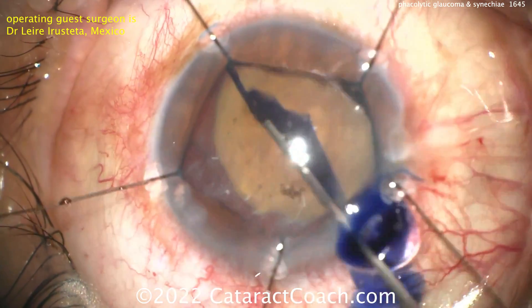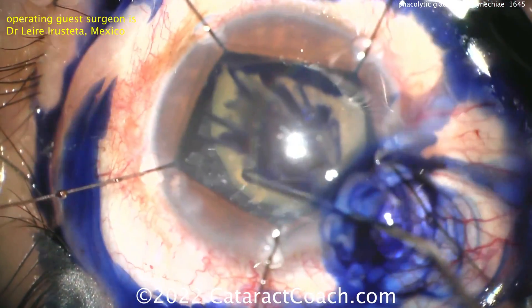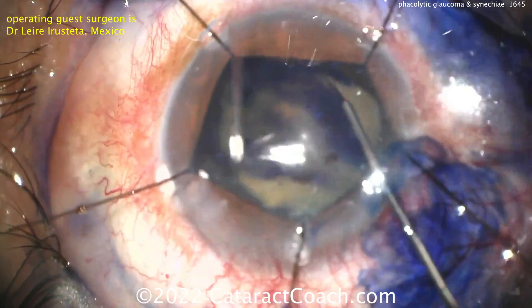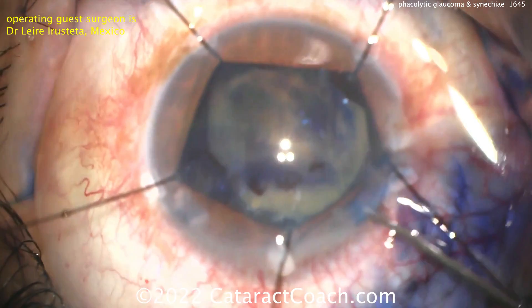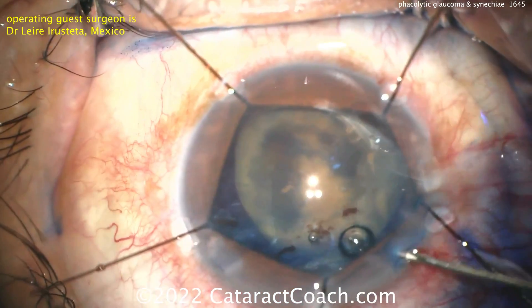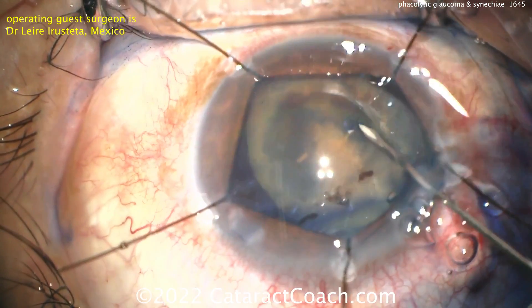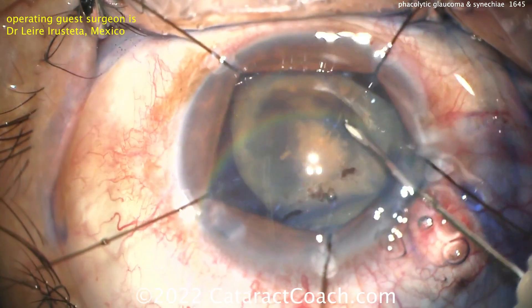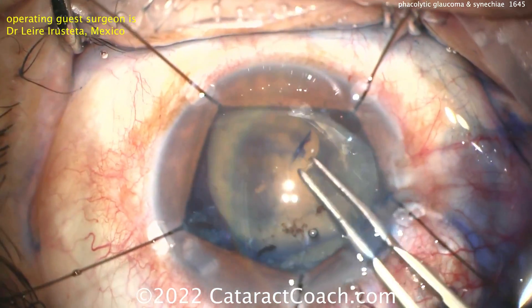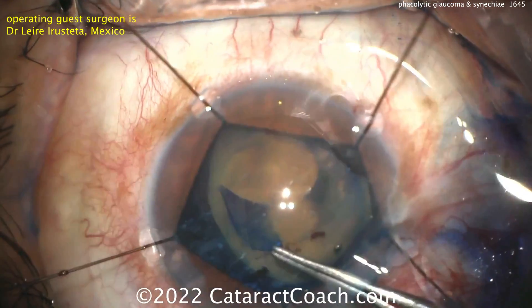With the faco incision, there's a hook on either side. Now it's a little tough to stain the capsule, and that's why the surgeon is injecting just a little bit of dye and sweeping or painting it on the anterior lens capsule — and that's because of the viscoelastic. More viscoelastic going inside the eye, and that's a sufficient stain to visualize the rhexis. It's poking into the lens capsule, not expecting too much liquefied lens cortex because it all leaked out. Flipping that capsule over — the capsule could be more on the fibrotic side, less elastic, and of course TriPan makes it less elastic as well.